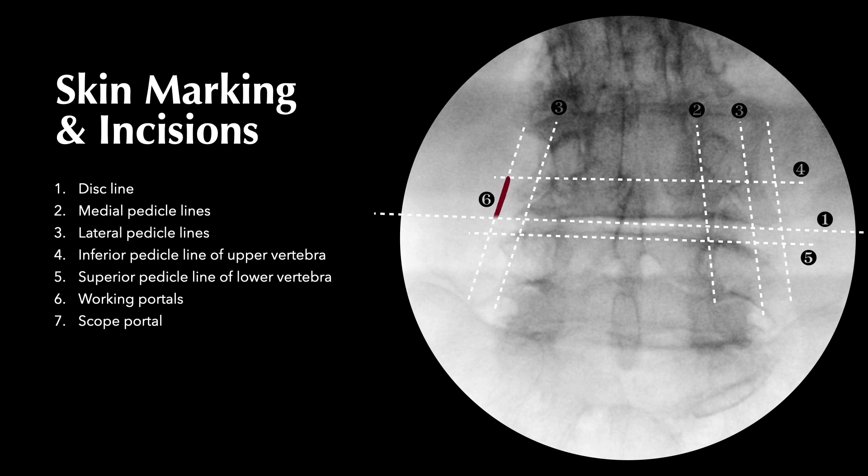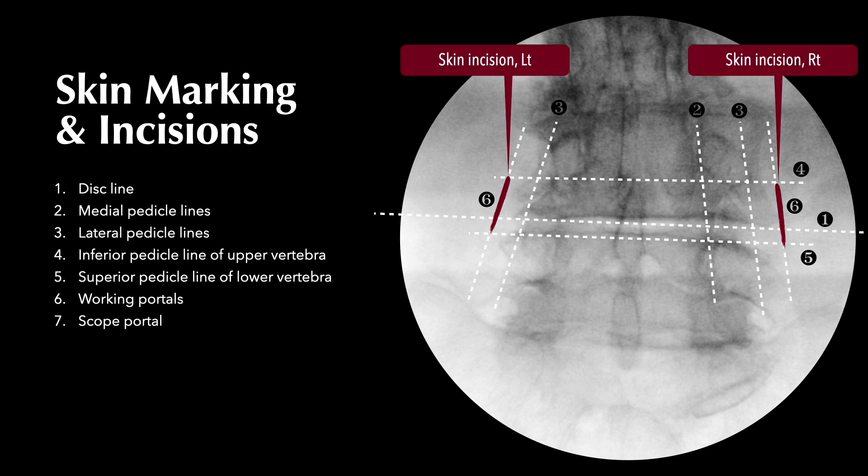The longitudinal skin incision is 1 to 1.5 cm lateral to the lateral pedicle lines, which is also used for insertion of pedicle screws. The length of the skin incision is about 2.5–3 cm for a 1-segment fusion and 4–5 cm for a 2-segment fusion.